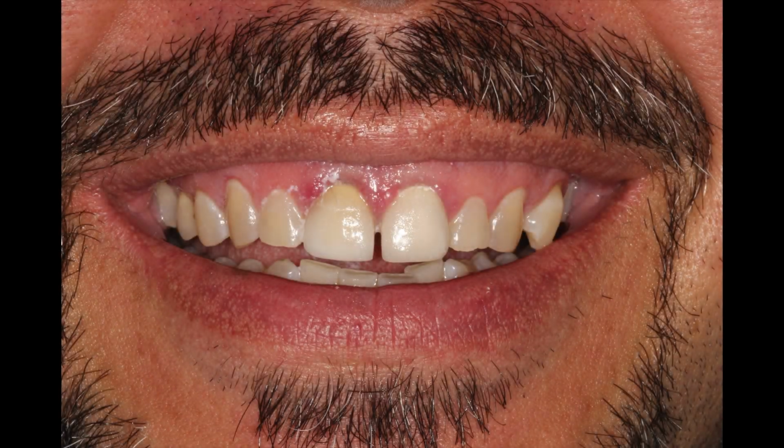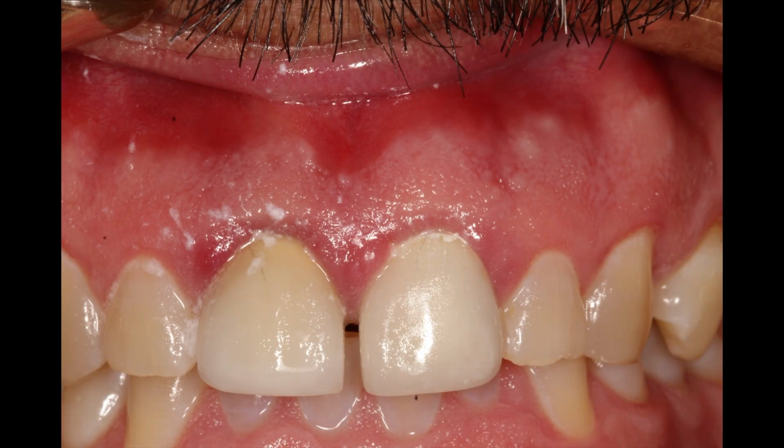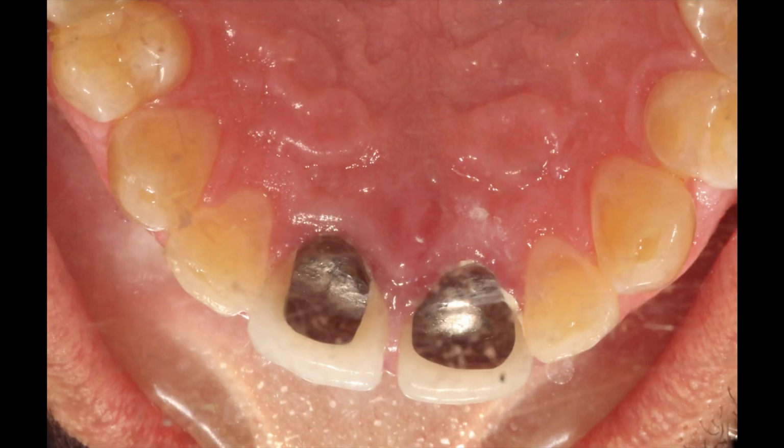Okay, so this patient presents in my office with an abscess around number 8. Here's a couple different looks at it. There's a close-up from the facial. There's a close-up from the lingual. Obviously, you can see the swelling around there.